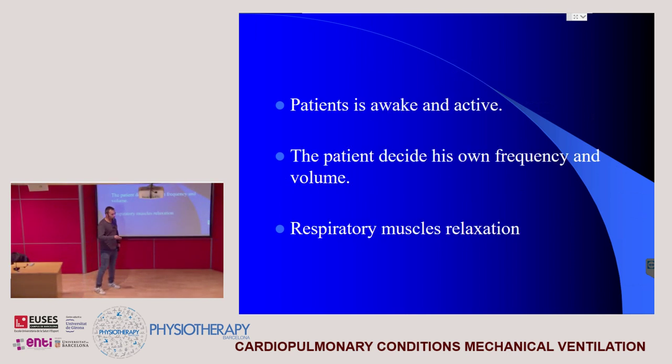Something that is extremely important is that if we want to ventilate a patient spontaneously, the patient has to be completely awake and completely active. And why? The reason is that the patient will decide on their own the frequency and the volume inspired. And the only thing the machine will do is try to relax or to help the respiratory work, the respiratory muscles' work.